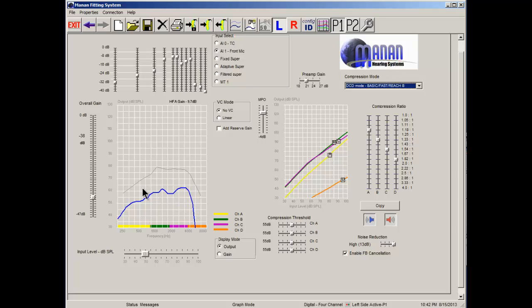And you can see that the data has changed, and this is the data that we just pulled in from the database. Now at this point I could go ahead and load this information back into the hearing aid, effectively restoring it back to that previous data point. Now there's one point that I want to make, is that this is a two-step process. When you're wanting to load data back into the left and right ears, you have to do this twice. You can see when I clicked on opening that data point and got back into this screen here, it actually defaulted to the left hearing aid. If I hit load and lock for this left side, it actually wipes out the data for the right ear.